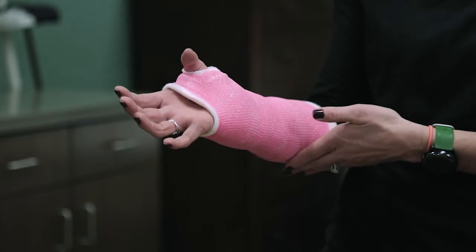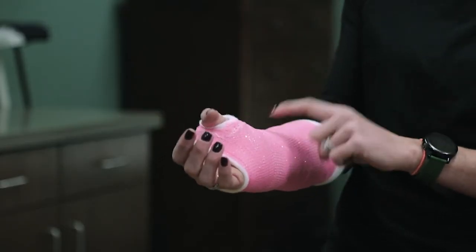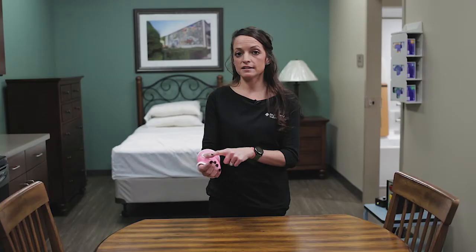Another reason to get the cast removed is if it feels like it's pushing pressure to the underlying structures, or if there's a dent or divot visible from the outside of the cast. The cast can also become itchy, but that doesn't mean it needs to be changed. Tapping the cast will help with the itch, which usually occurs when the bones underneath are healing.